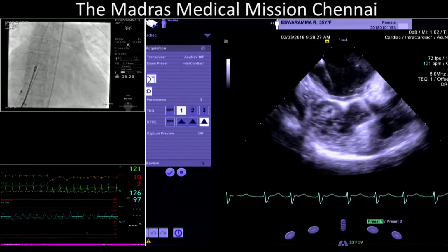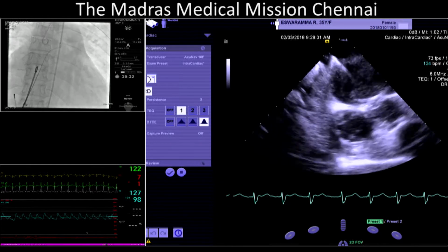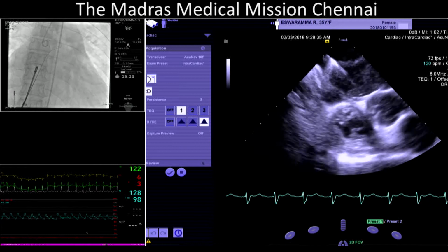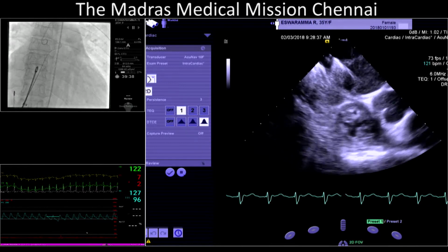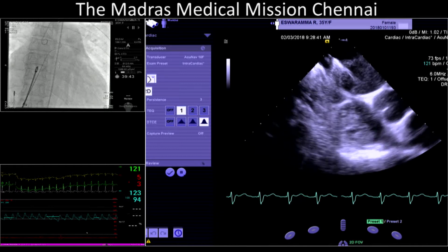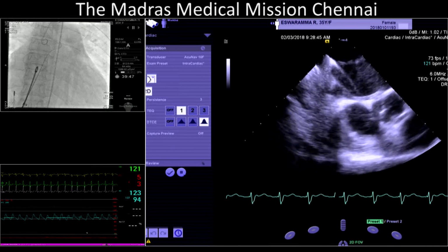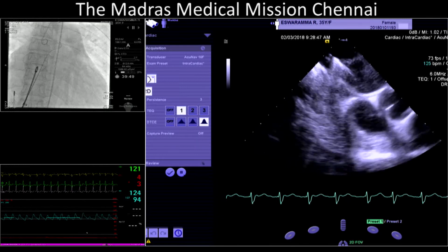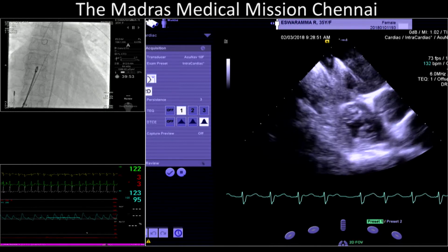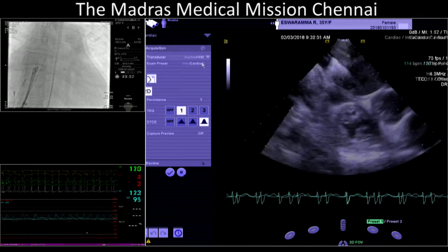Perhaps you could give us a transthoracic picture too when you've finished. Sure. Shiva, we are just a little bit in a time crunch. In about 2 minutes, we'll have to go back to 10. So if you want to show us something in the next 2 minutes, that'll be awesome. I'll get the pictures. You go to tin and come back. Okay, we'll go to tin because your case, I think there are a few more questions people will ask. So let's go to tin.